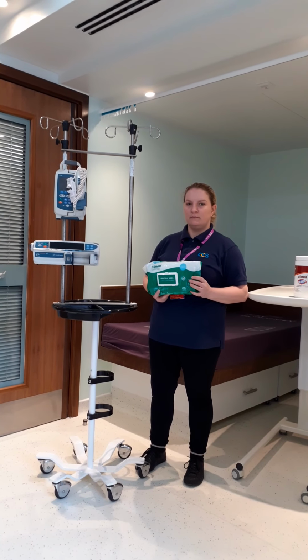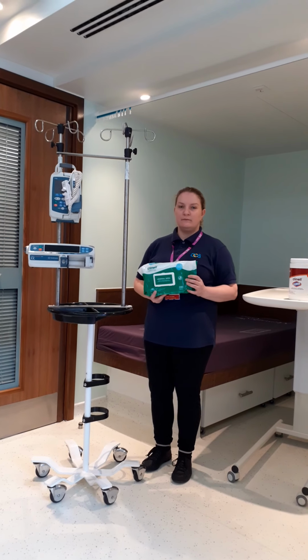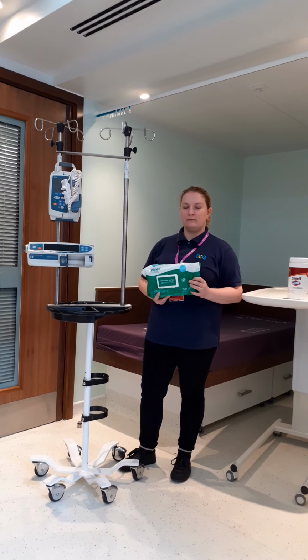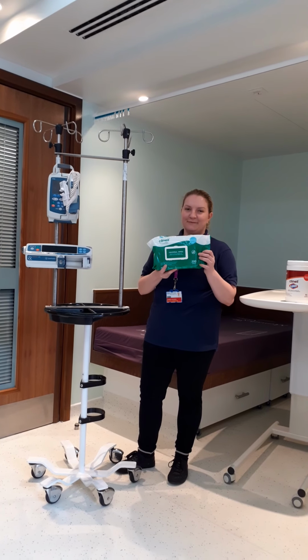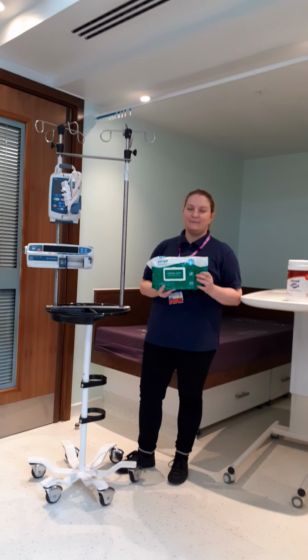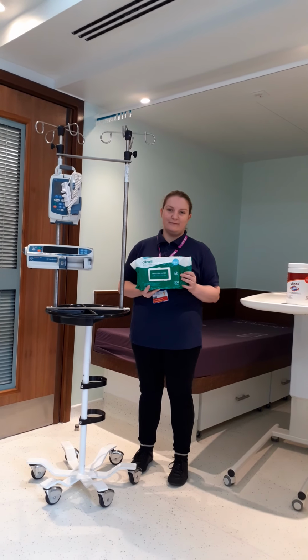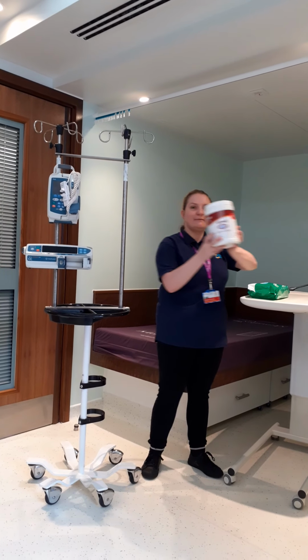We're going to ask you and demonstrate how to do it as part of a discharge clean. The concepts are pretty similar. The first thing you need to do is choose your wipe. So we would normally ask you to do this with the green Clinell wipe. You may, given different clinical circumstances, be asked to do it with the red Clinell Clorox wipes that contain chlorine.